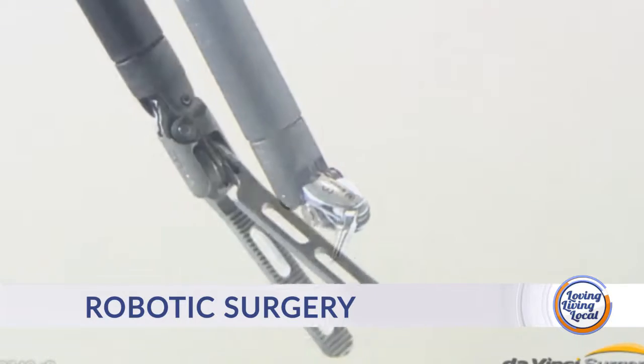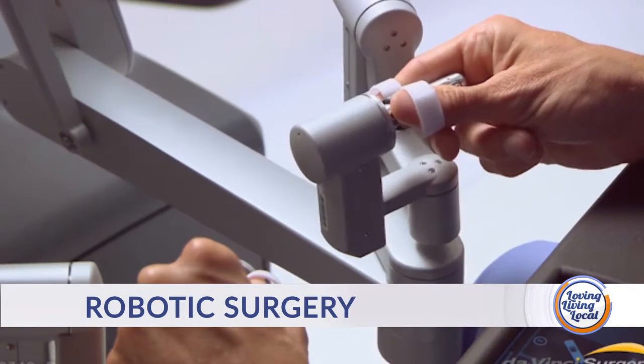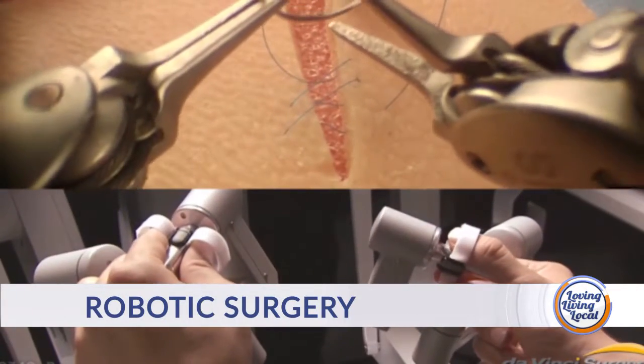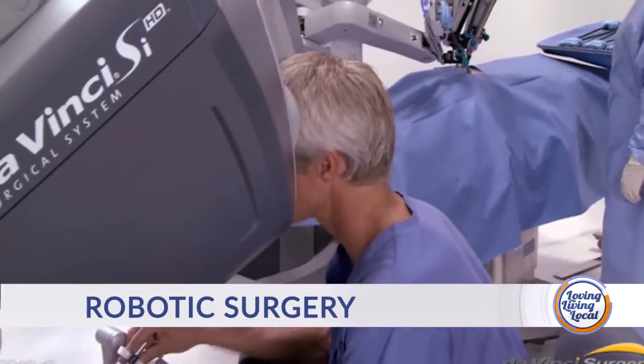When it comes to robotic surgery, is there ever a time where someone's not a candidate, or is everyone able to have robotic surgery? It's a great question. Obviously, you have to first determine whether or not the patient's a surgical candidate. And then patients that have a lot of pulmonary disease. Sometimes some of the positions that we place our patients in could be a little tough in terms of ventilating the patient. So you have to make sure that it's a safe approach for every patient. Most of the time it's ideal over traditional surgery, but every surgeon has to have that conversation with the patient in terms of determining the optimal approach. You could do it robotically, laparoscopically, or traditionally open.